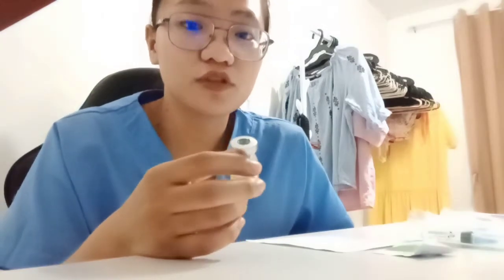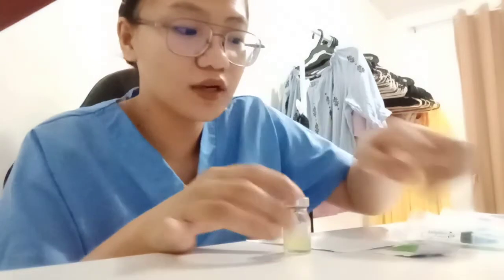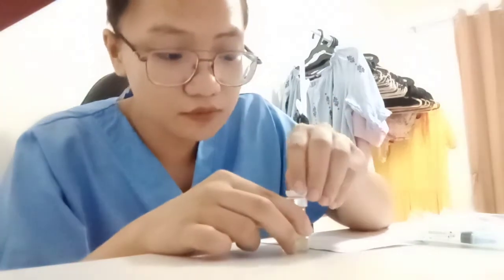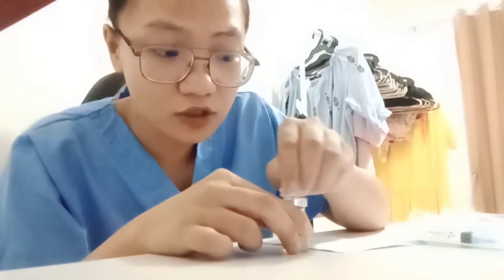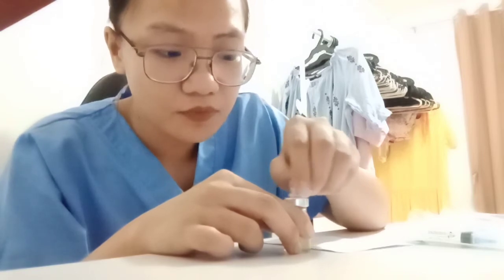Next is to prepare the vial for reconstitution. Read the manufacturer's guide. Next is to clean the top of the vial by rubbing it in a circular motion so that there would be no contamination. Now we go into withdrawing the medication.